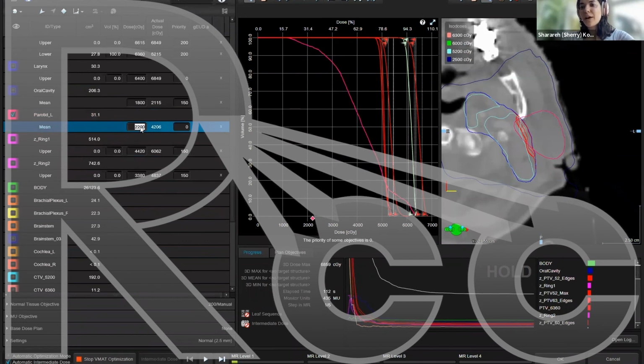One more quick question. How do you describe an overmodulated plan, and what's the implication of optimizing a plan multiple times to achieve a perfect plan? Another good question. We don't want to over-optimize a plan. If you follow this process, you will only have one optimization. If you have to do multiple optimizations, you need to refine your skills and follow exactly this planning document. If you optimize multiple times, you get a higher modulation factor. That means more MUs per dose, and that means more difficulty for your planning system to deliver.